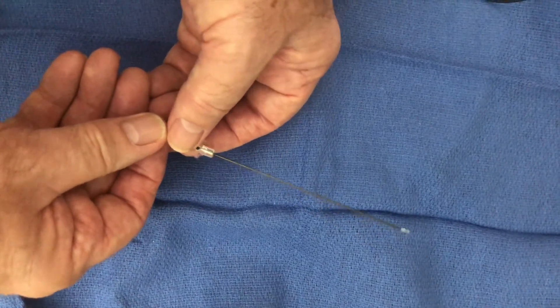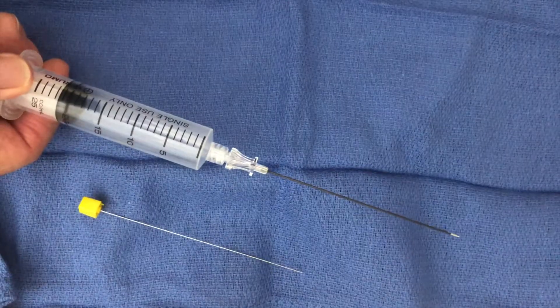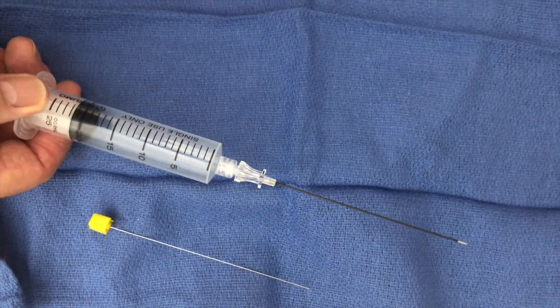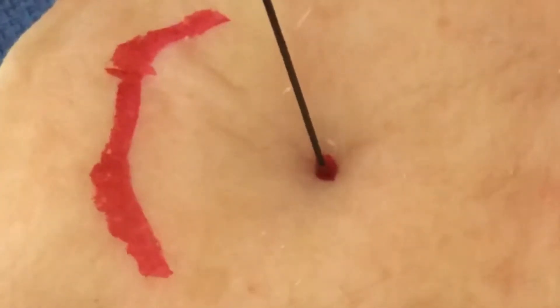For the injection of local anaesthetic, it's best to use a spinal needle with the stilette removed. 20ml of 1% lignocaine is usually used. Local anaesthetic is first injected subcutaneously to a diameter of 2cm at the site of suprapubic insertion. The needle is inserted 3cm above the pubic symphysis and held vertically at all times. Injection is carried out as the needle is passed in and will easily go through the skin and superficial fat. It's a little harder having to push it through the linea alba of the rectus sheath, but it'll pop through that and into the extravesical fat and then into the bladder, where aspiration can be carried out to ensure that the right path has been taken.